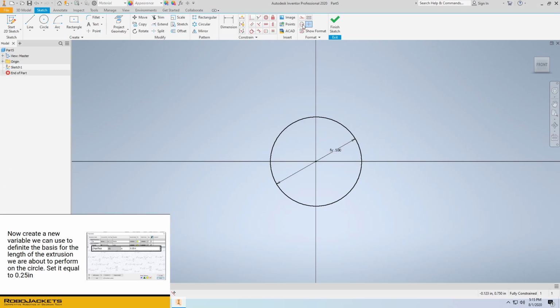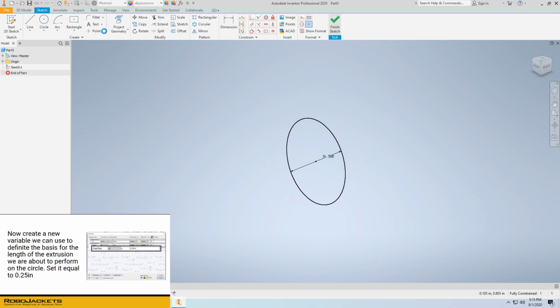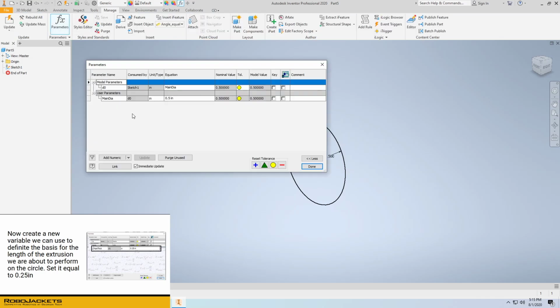Now we'll create a new parameter called main thick. Once again, go up here, add a numeric, name main thick, and we'll edit this to 0.25. Gotta get rid of that first. And there you go.